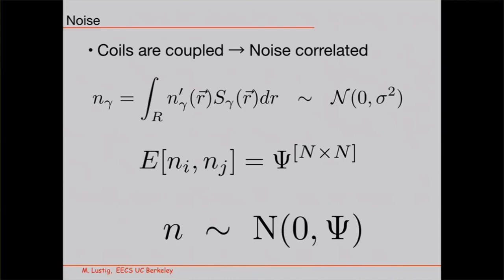Let's say you're just receiving and you didn't excite, so you're just receiving noise. All I meant was we're definitely not looking at the magnitude image, because the magnitude wouldn't have zero mean. This is raw k-space data. Yeah, that's right. Okay, that's all I wanted to make sure.